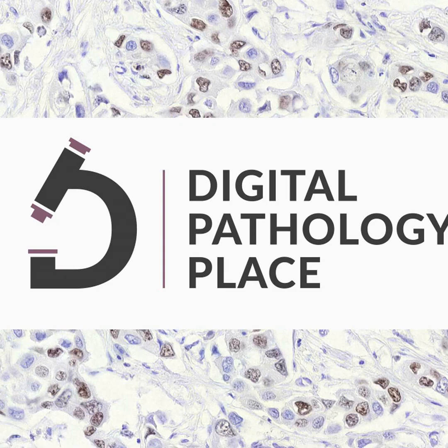So in that case, if you have unlabeled images from your target domain, you could take the model adaptation approach to recompute some of the statistics, and that's only possible with some models. Other than that, it tends to be a combination of the other 3: adversarial domain adaptation, color augmentation, and stain normalization.